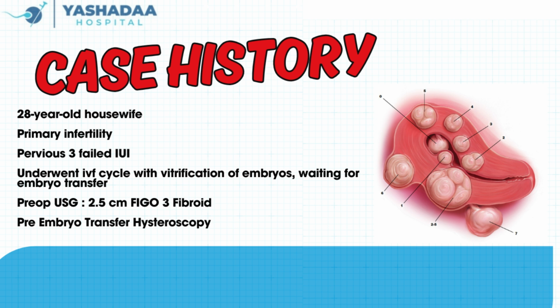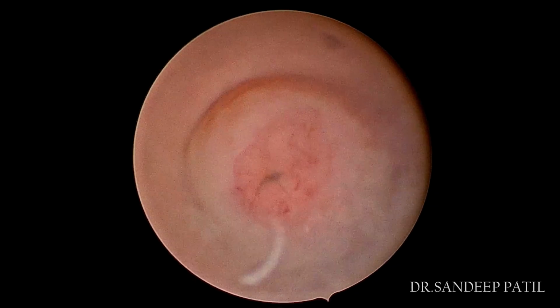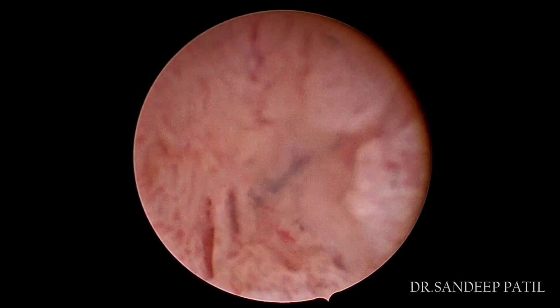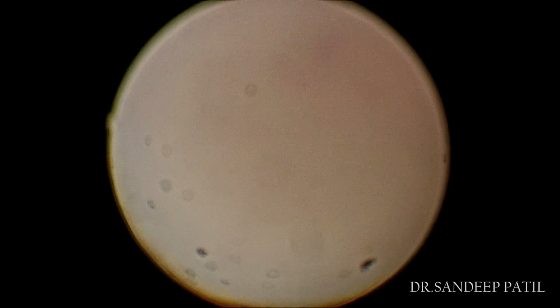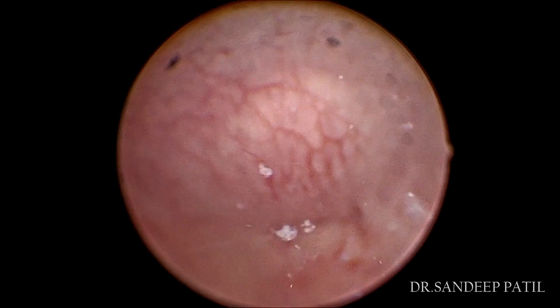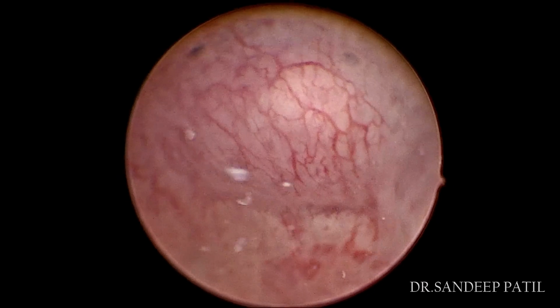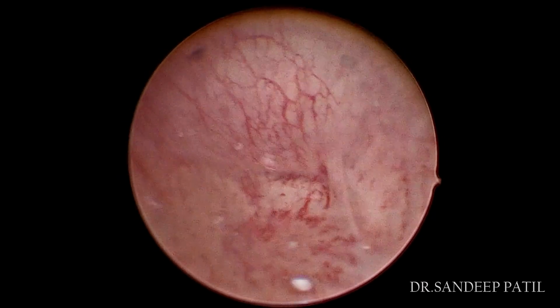3 fibroid. In recent years, we have adopted the vaginoscopic approach for hysteroscopy. While our hysteroscope is navigating into the cervix, you can see the external os showing erosion, and the hysteroscope is entering the cavity. The distension medium used here is normal saline, and you can notice significant endometrial debris or sloughing seen as floating debris in the fluid.